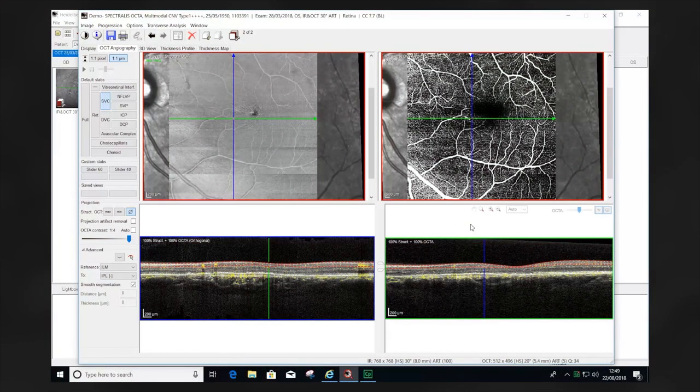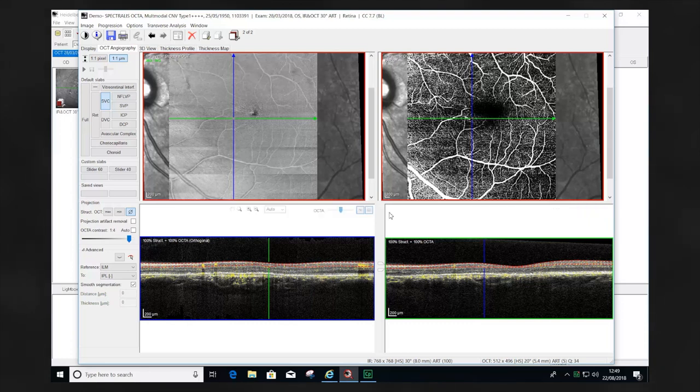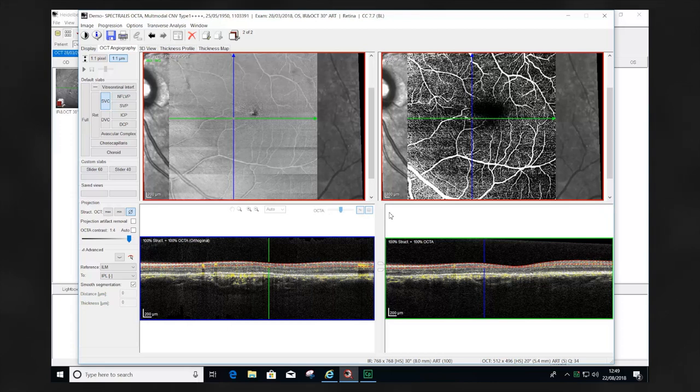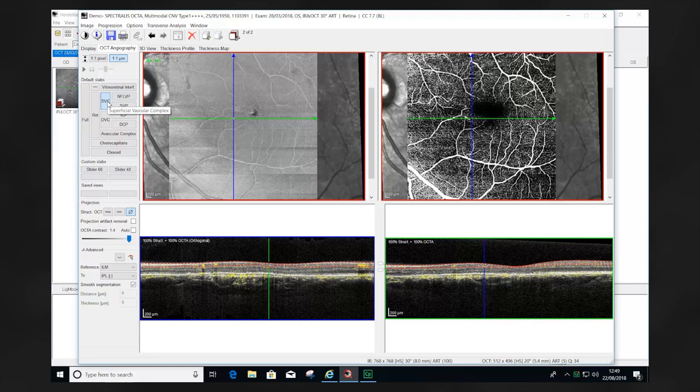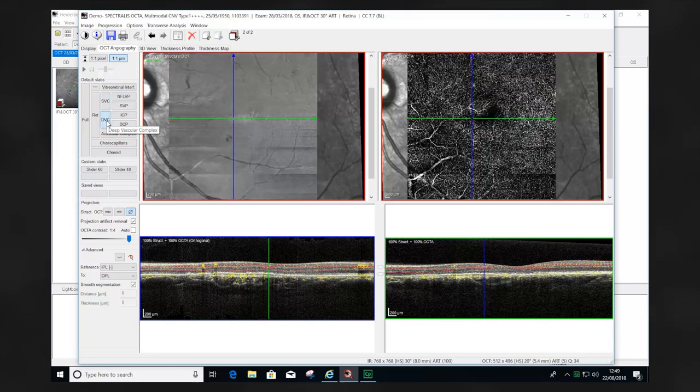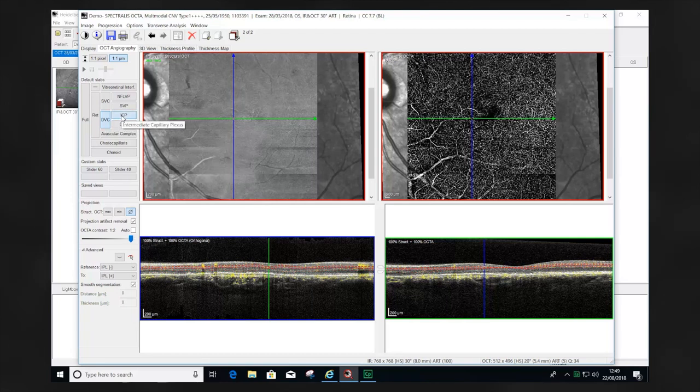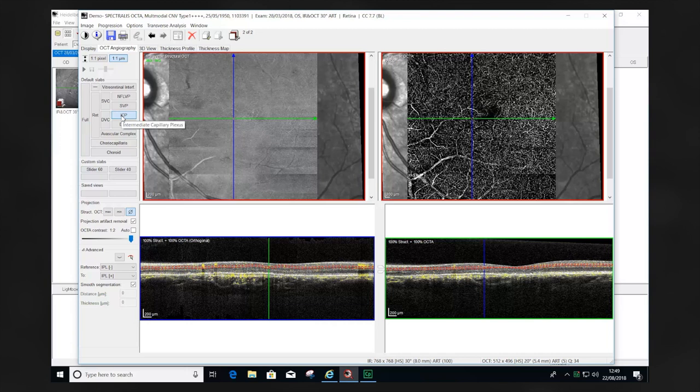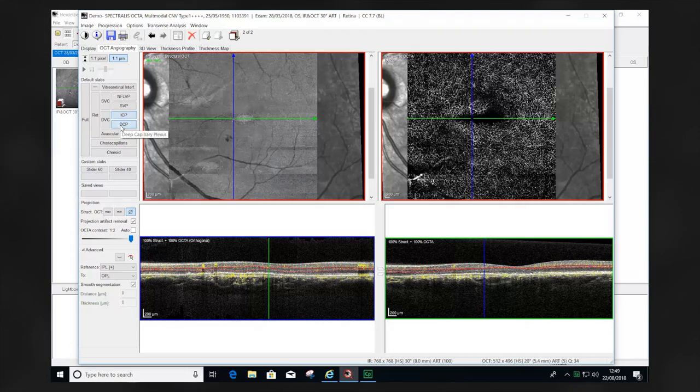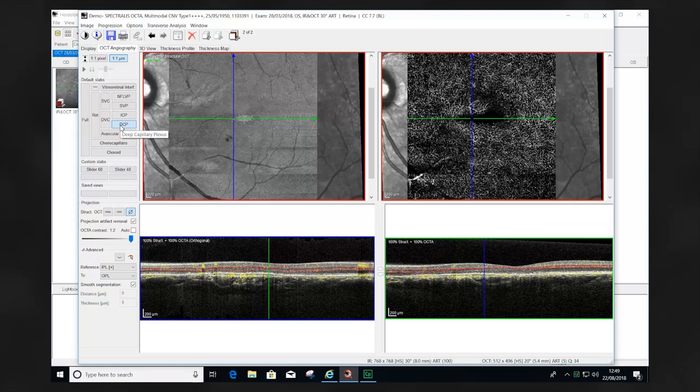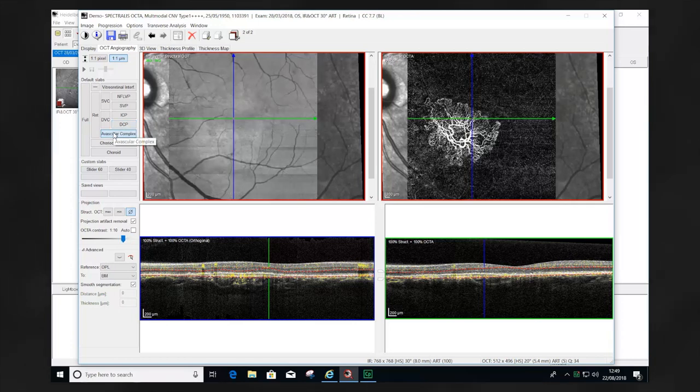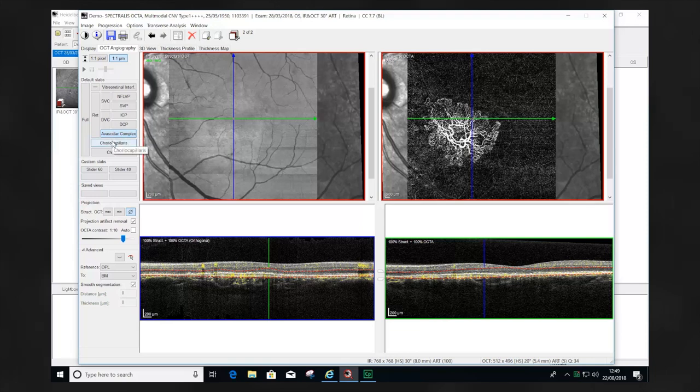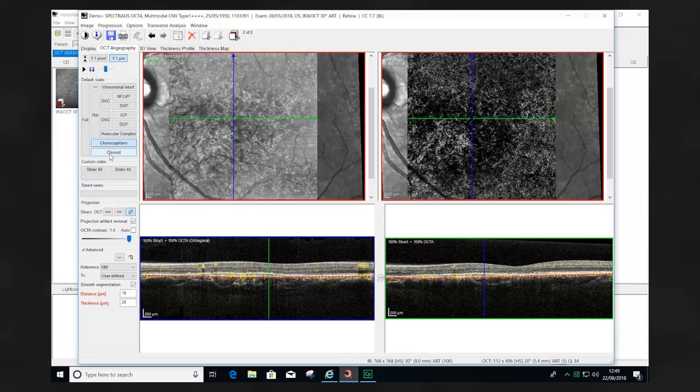Once the full image of the OCTA has been reviewed and abnormality may be identified, it's now important to try and identify where this is within the retina. This can be done using the predefined segmentations. The superficial vascular complex can be viewed first, following that the deep vascular complex. Following this, we work our way through the retina into the intermediate capillary plexus, then the deep capillary plexus to look for the foveal avascular zone, the avascular complex, furthermore the choriocapillaris, and then the choroid.